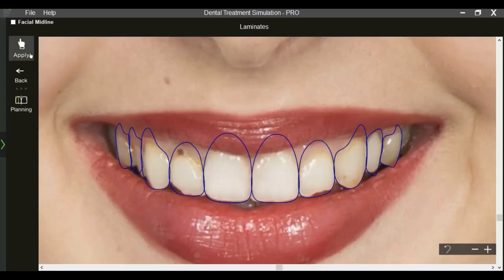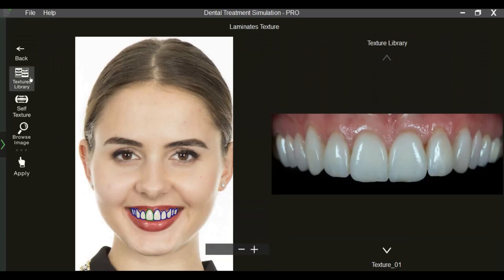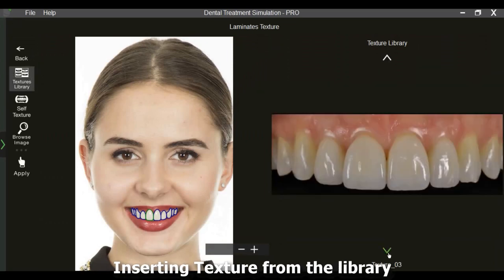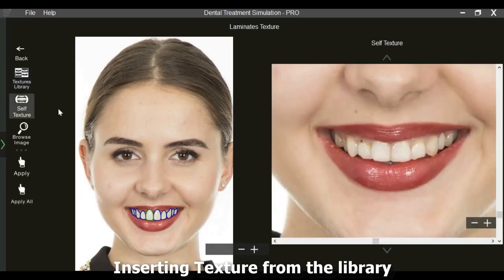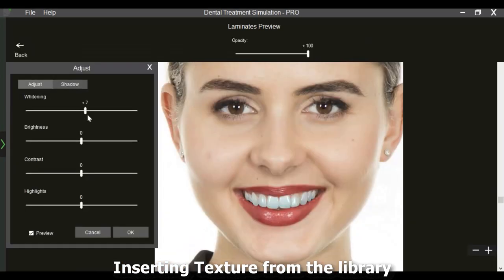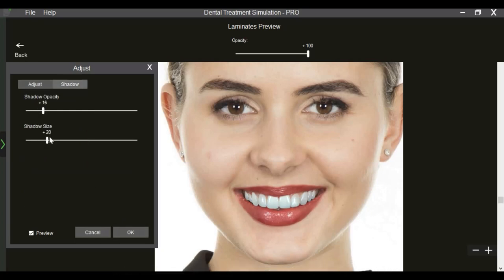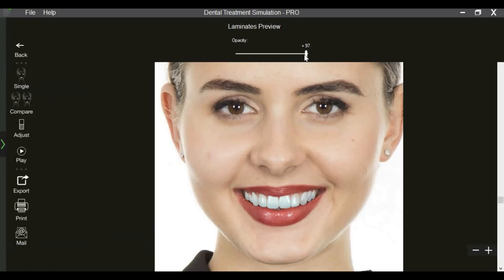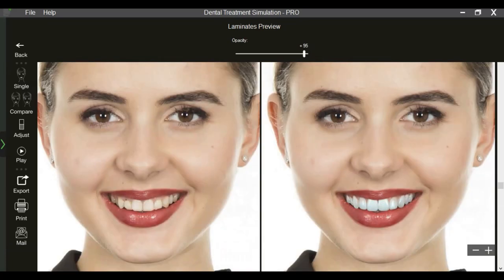Once the templates have been designed, we can insert textures from the library, which automatically fills in sample textures, or we can use the patient's own tooth texture. The shade, brightness, and contrast of the texture can be adjusted as required. Lip shadow and texture translucency can help create realistic simulations, making the patients a part of the decision-making process.